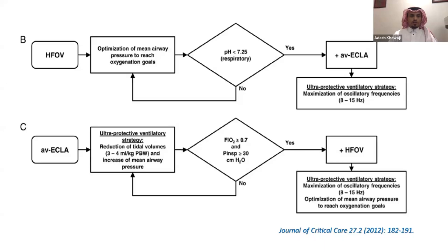So Abdallah, in your scenario, when you are avoiding the high frequency machine in cardiac ICU, do you think it's really having a bad effect on the hemodynamics, or it's just not indicated in this scenario? I cannot say we are avoiding it. We used it before, but at the end, you might go to ECMO.